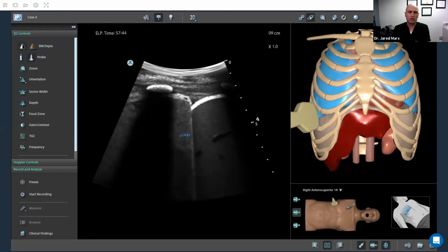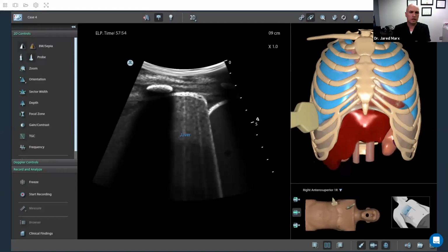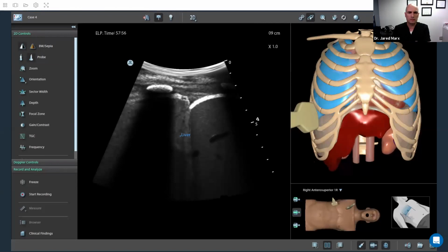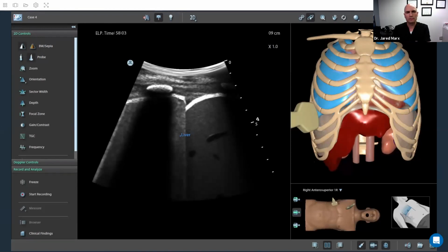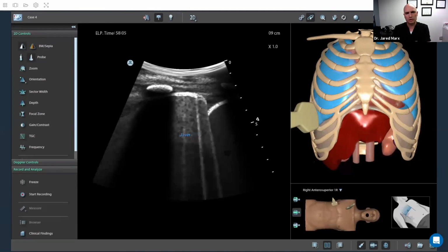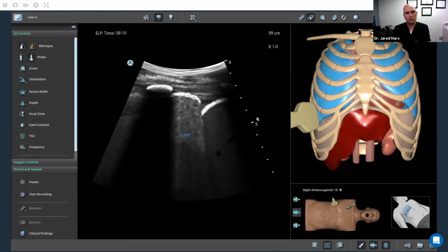Even in that flyer that I had developed before, the point was to show people that B lines are the first thing you'll see, and then irregular pleural lines the second. And then something called air bronchograms, which is not displayed in this model, is usually a later, more severe finding, and those are the patients typically having more difficulty. And as we know in COVID, much of that is acute respiratory distress syndrome, and those are the same type of findings that are shown in those.